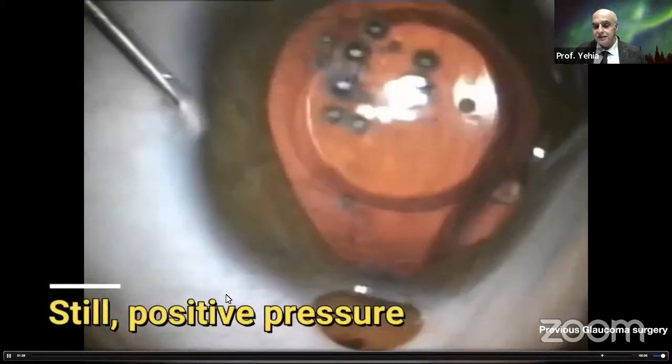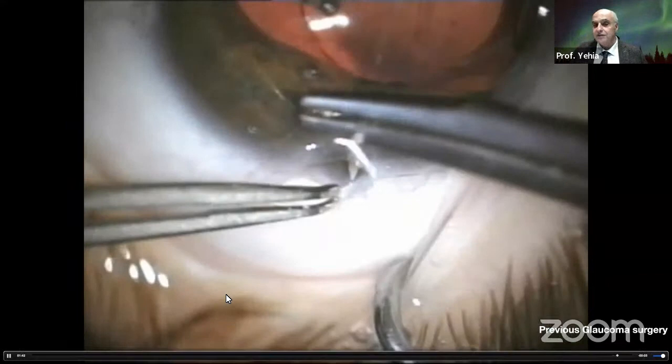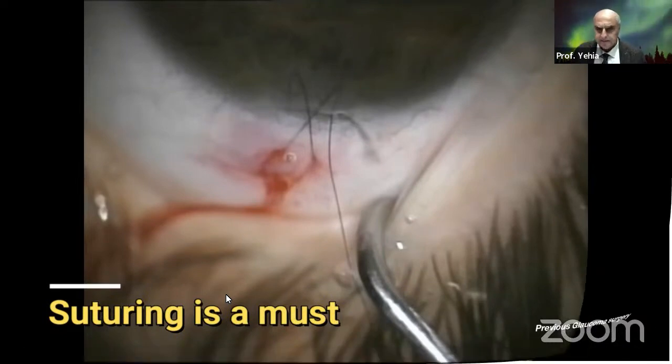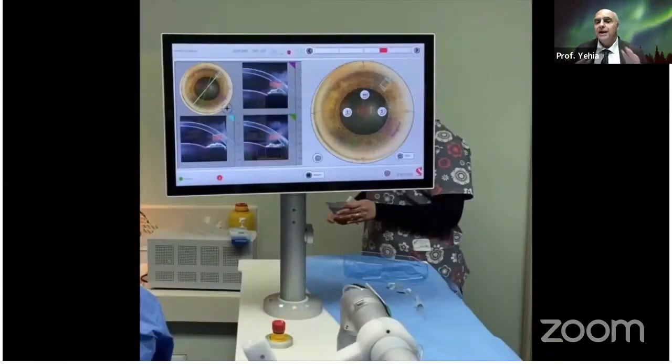In such patients, if you have this iris prolapsing, you have to suture the incision. Don't risk having an incision that can be compromised in such patients, because you can even get postoperative suprachoroidal hemorrhage, which is a great risk in these patients. So actually, I've done this patient's other eye. After this experience, I decided that I don't want to enter the eye except when I do phacoemulsification. So I decided to use femto laser.